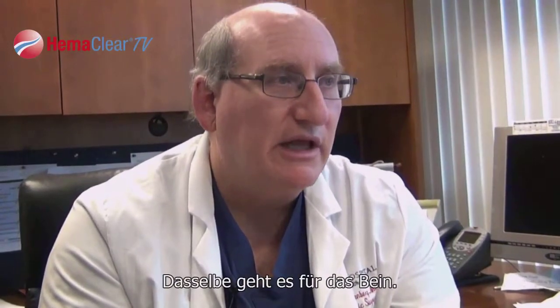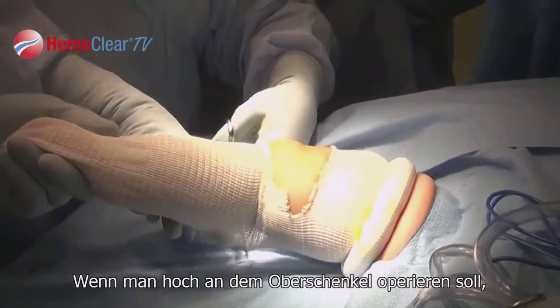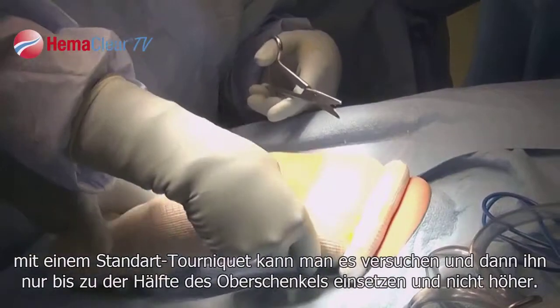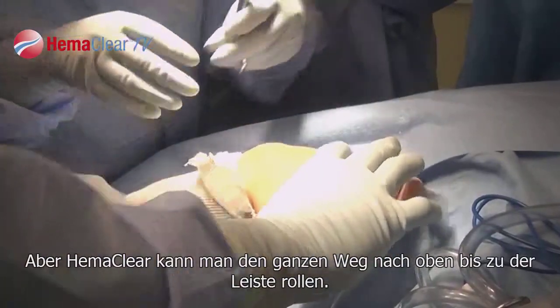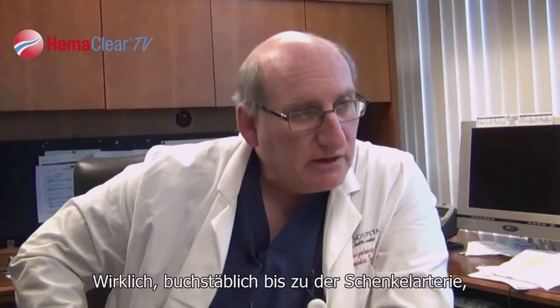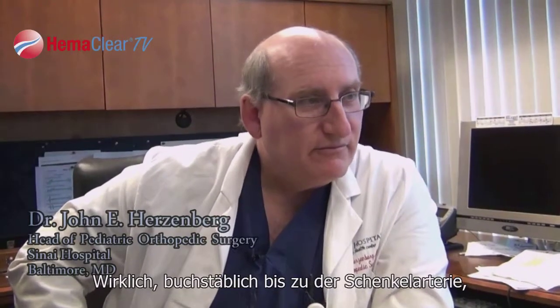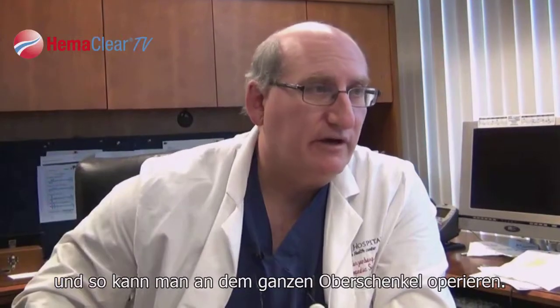The same thing is true in the leg. If you want to operate high on the thigh with a standard tourniquet, it comes at least halfway down the thigh and that's as high as you can get. But with the HemaClear you can roll it all the way up to the groin — literally up to the femoral artery — and you can operate on almost the entire thigh.